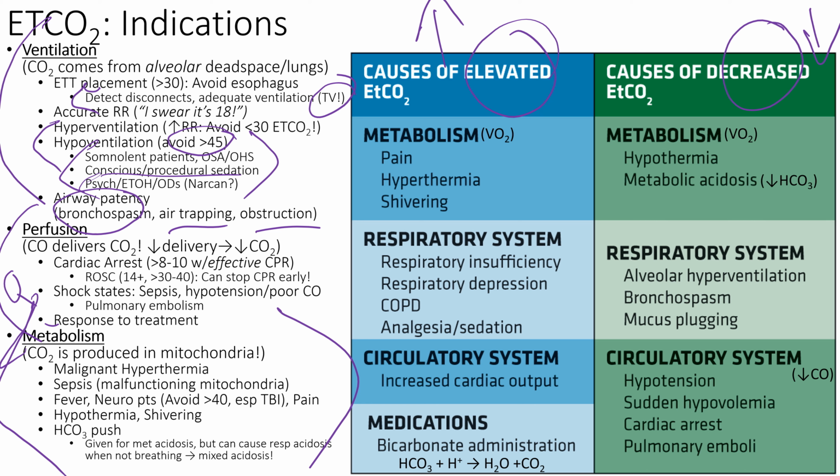All right, so then perfusion. It's non-invasive. So usually if it's non-invasive, it probably doesn't need an exact order. Well, with BiPAP, you can't do everyone because BiPAP doesn't really have a good way to attach it, because it's going so fast. And Vapotherm is going way too fast too. But cannulas, if they require 8 liters or less, we can throw them on this cannula. Okay. So that's all ventilation stuff, now perfusion stuff.